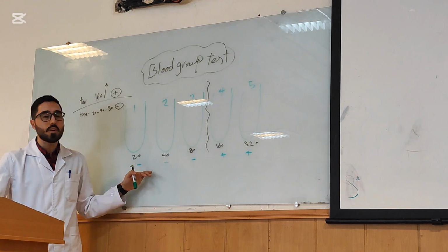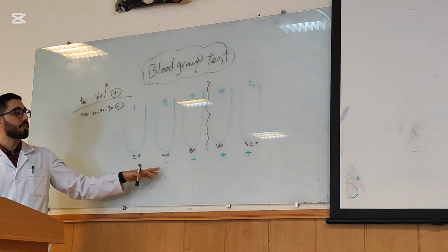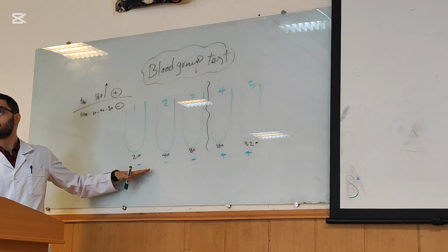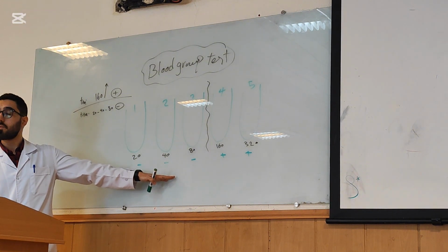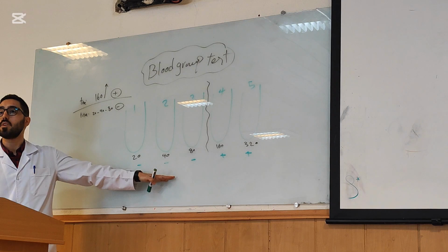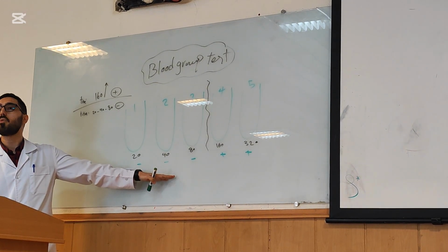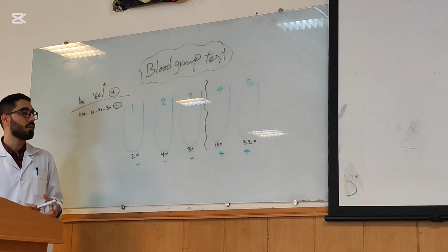If we see agglutination in third tube or two tubes or only one tube, we call it negative. And my patient is healthy, and your patient hasn't brucellosis. Okay.